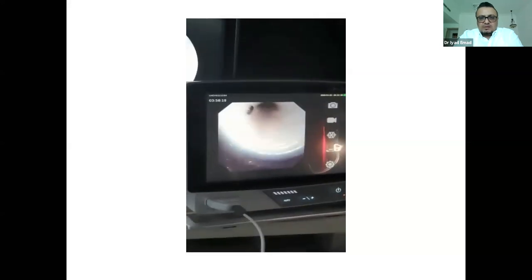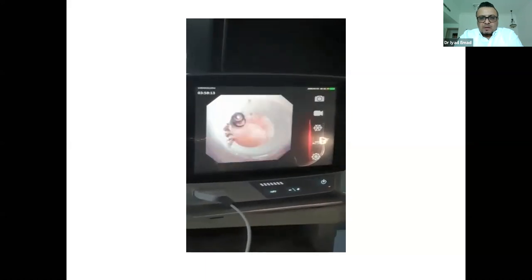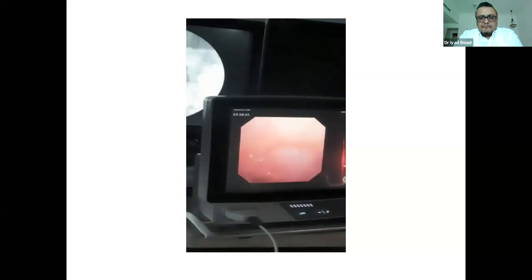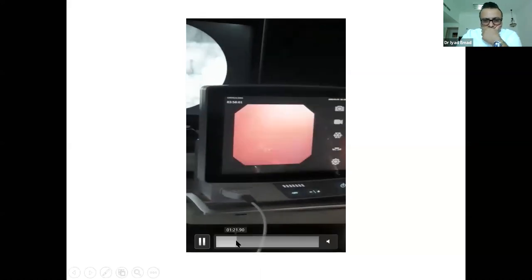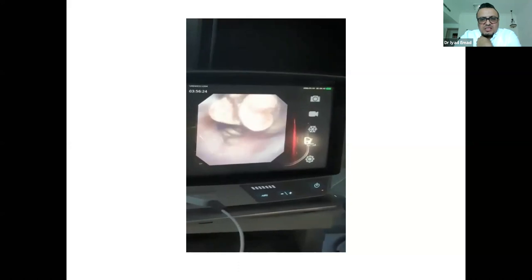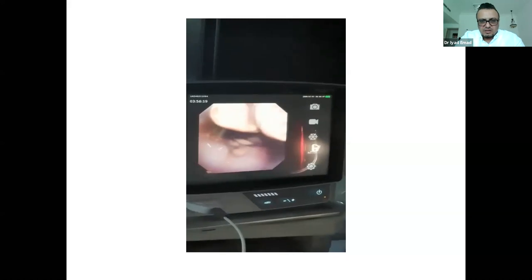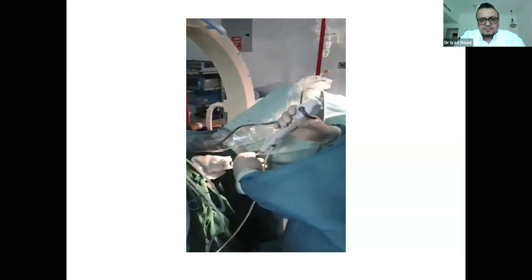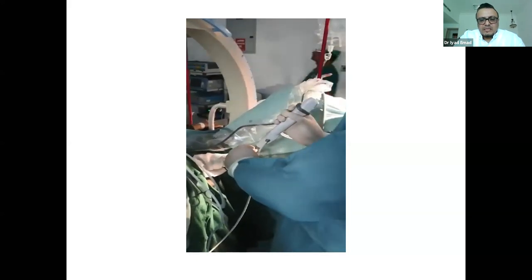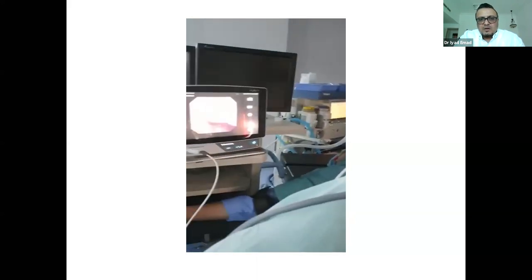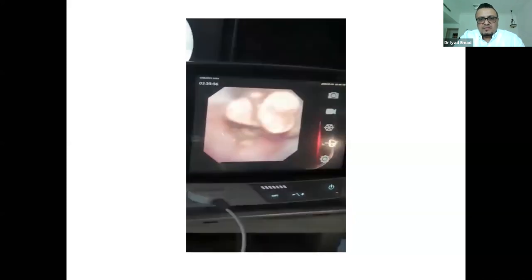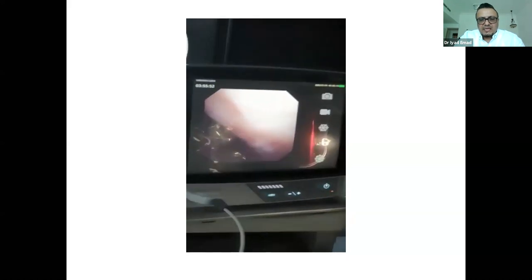Going through the access sheath to the pelvis — sometimes there are difficulties negotiating this part, then entrance becomes easy. These are all unedited videos. You can see the stone — image quality is perfect. You can perform lithotripsy, but my advice: once you see the stone, do not proceed immediately. First assess movements right and left, micro-movement near the access sheath, and evaluate all pelvic calyceal system anatomy. Do not go immediately for lithotripsy.